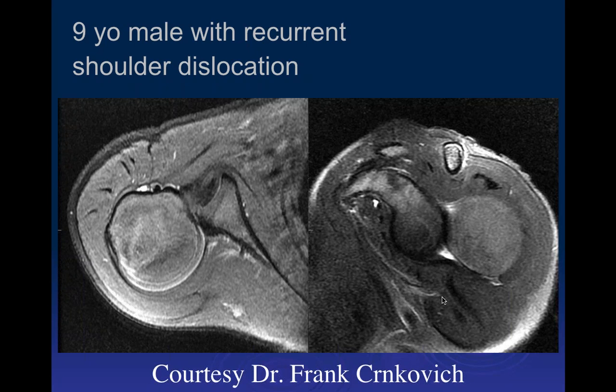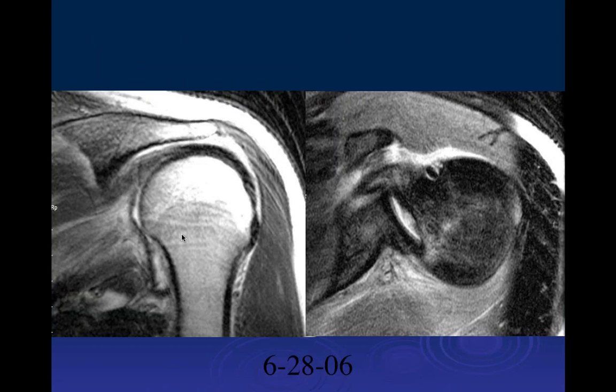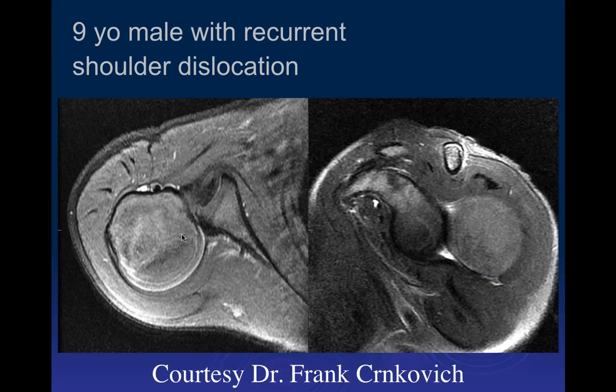PD-FAT set, okay. So here we can see that the humeral head is interlocking with the posterior glenoid as well as the labrum. There's some blunting of that labrum, so it looks like it's some labrum injury. So it's fairly posteriorly dislocated. Yep. So image is showing it very nicely. We don't see a good posterior labrum here. Sure it's torn and maybe displaced over in this area. Mm-hmm. So that's a posterior. And this is probably more of a chronic posterior dislocation, I would imagine. And this particular kid, this probably isn't the first time this has happened.